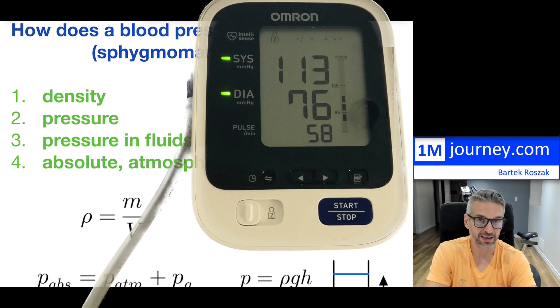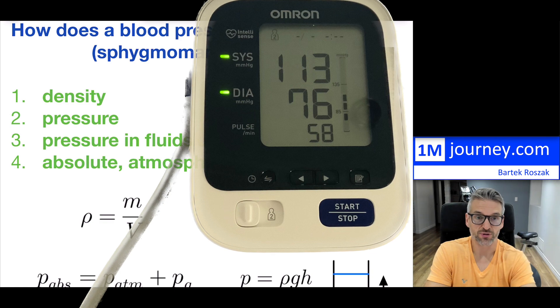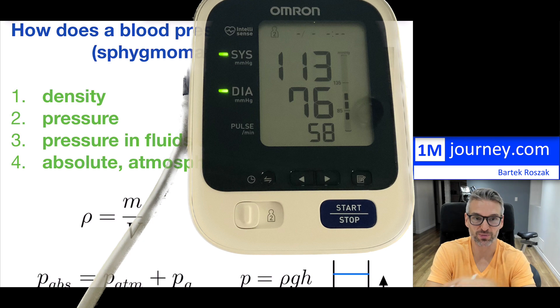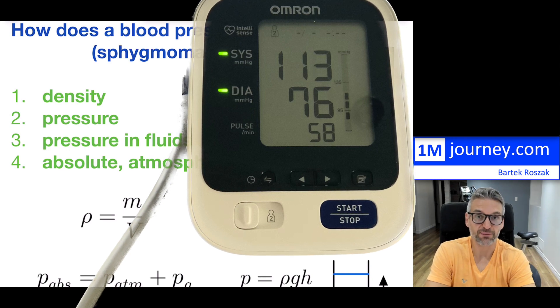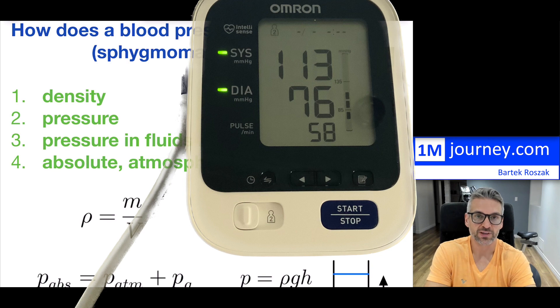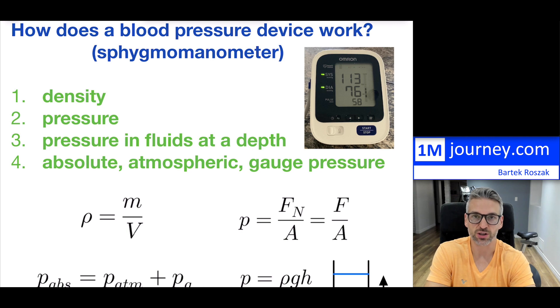Notice the actual reading: 113 and 76 — those are mine. I'm very happy with that. It also shows me a 58 BPM heart rate, and this is in the middle of the day which is actually pretty good.